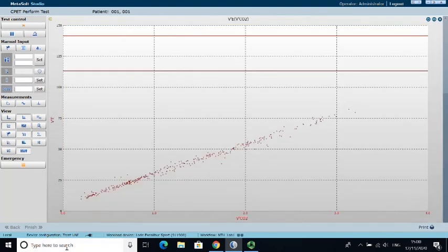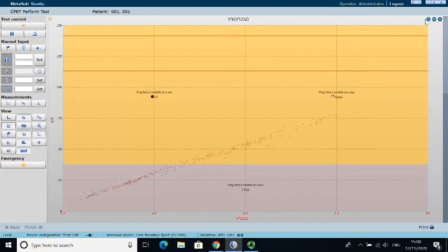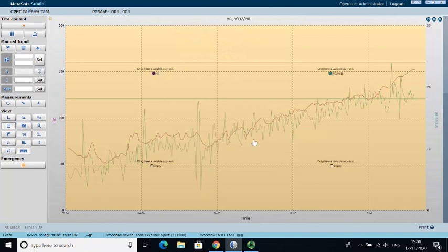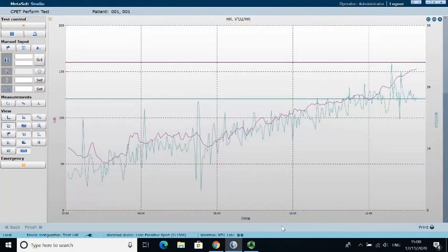Right, and I'm just highlighting this relationship again here. So look how straight that line is. We're increasing our CO2, therefore we're increasing our ventilation. As he continues to do more work, he'll continue to produce more CO2, and then he'll continue to ventilate at a higher rate.